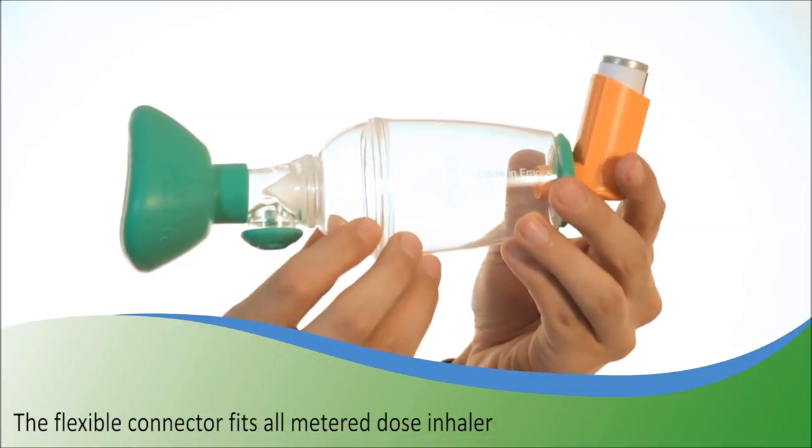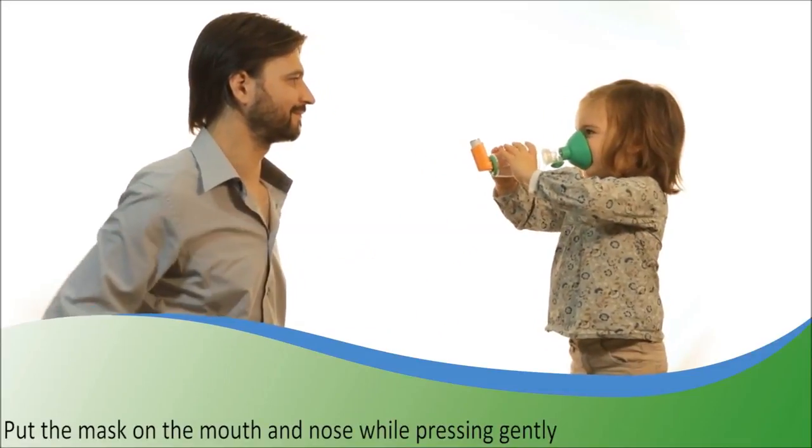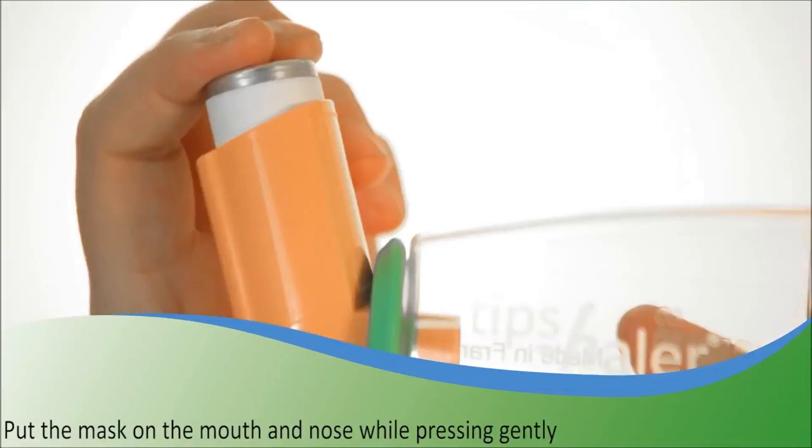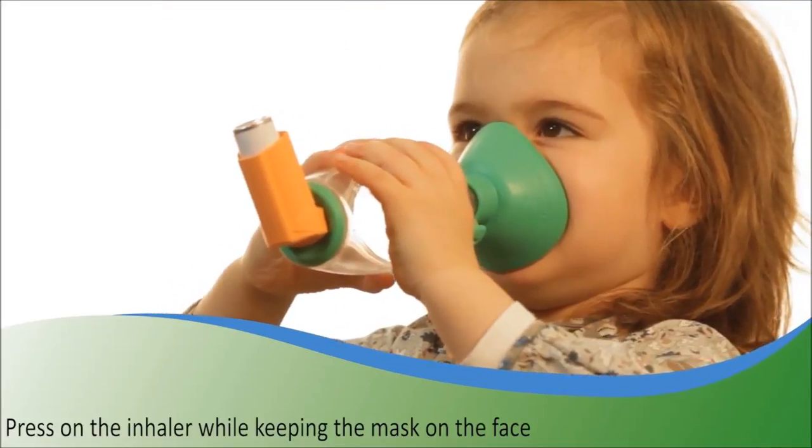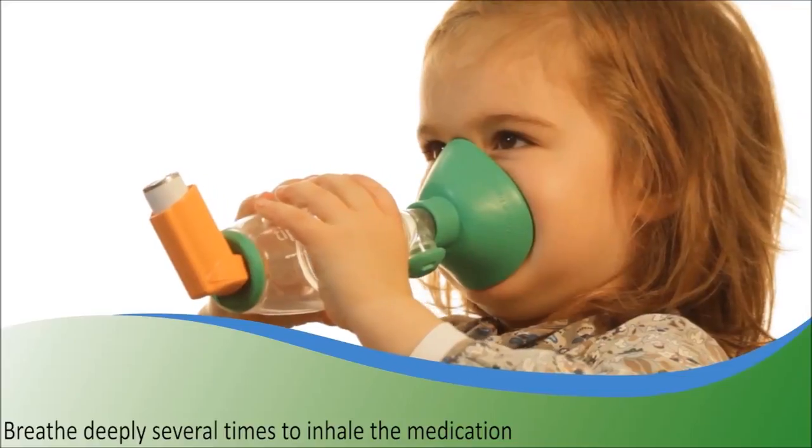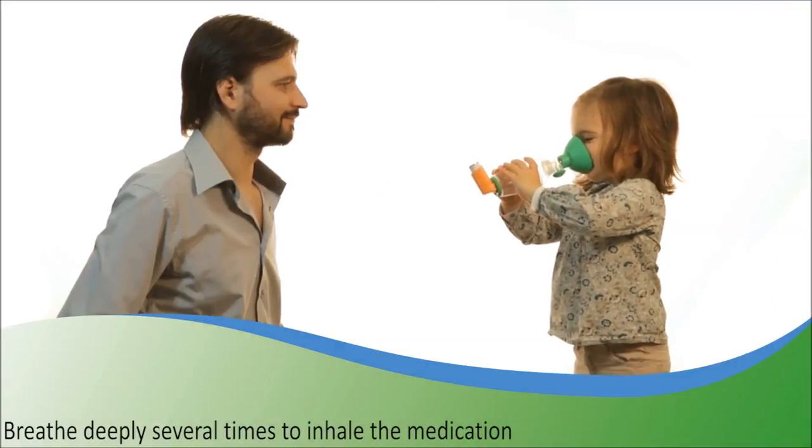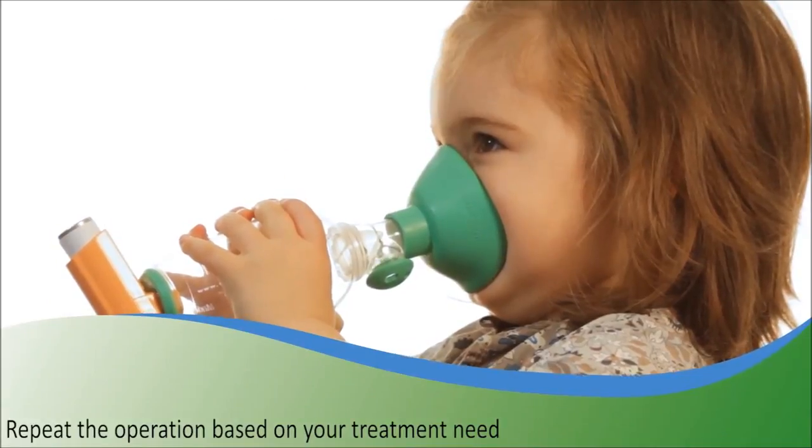Tipshaler fits any metered dose inhaler. Put the mask of Tipshaler on the mouth and nose and press gently to form a good seal. Press on the metered dose inhaler to release a puff of drug. Let the child breathe five to six times. If necessary, repeat the process according to the physician's instruction.